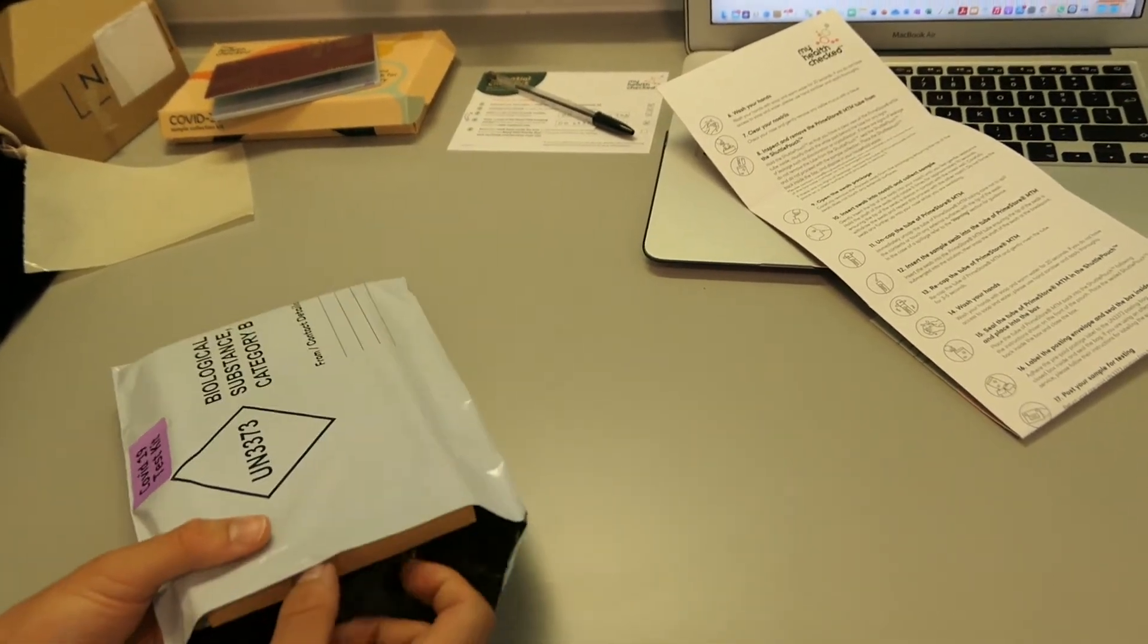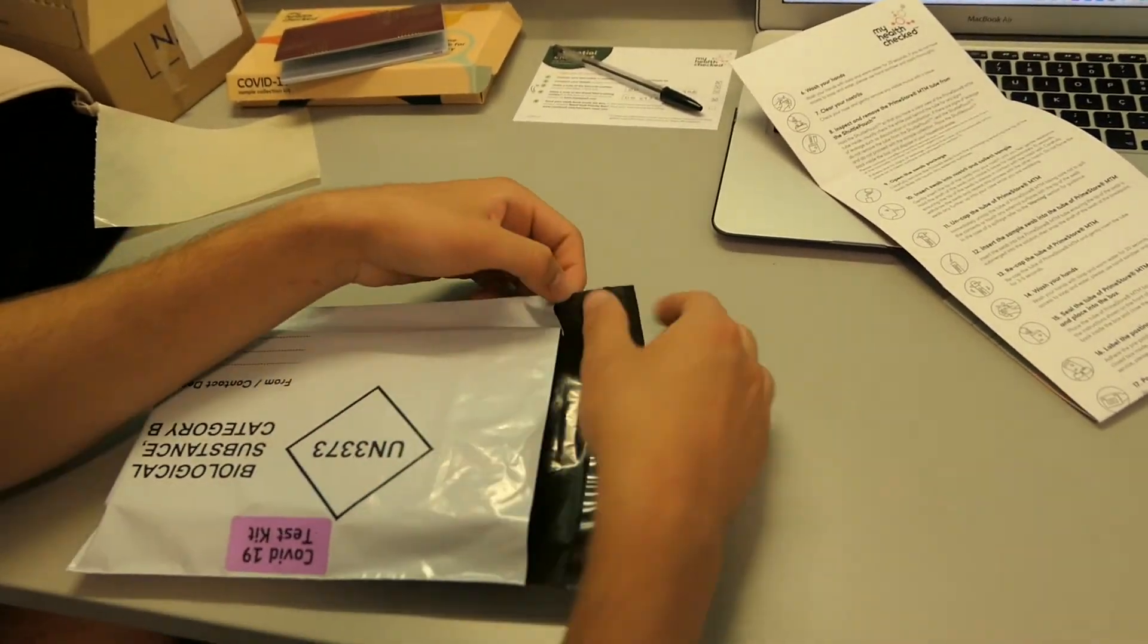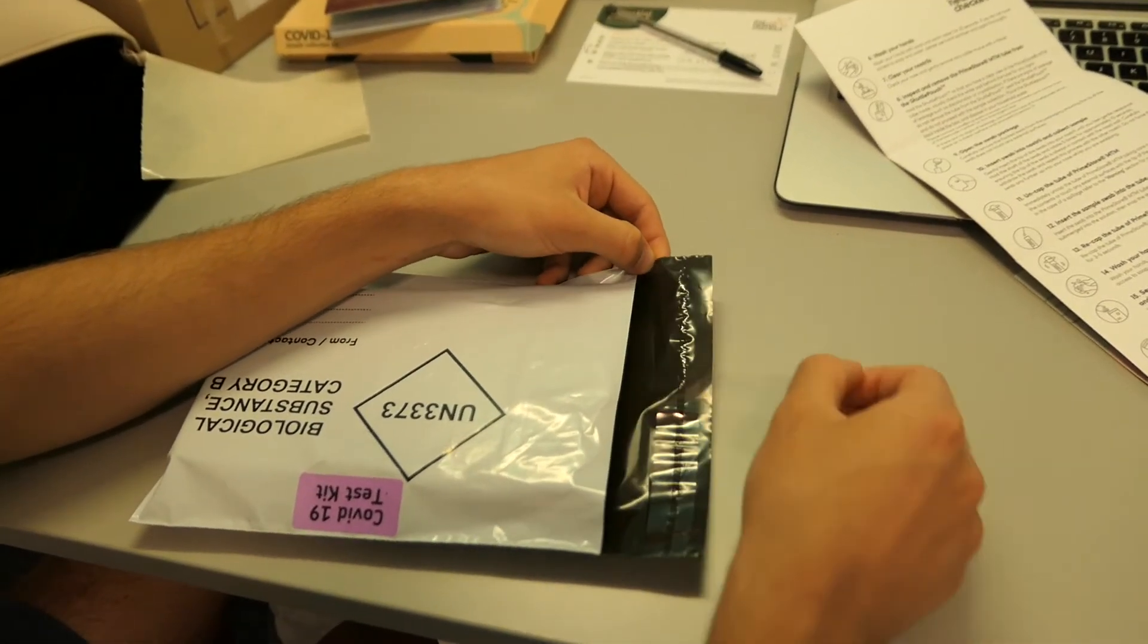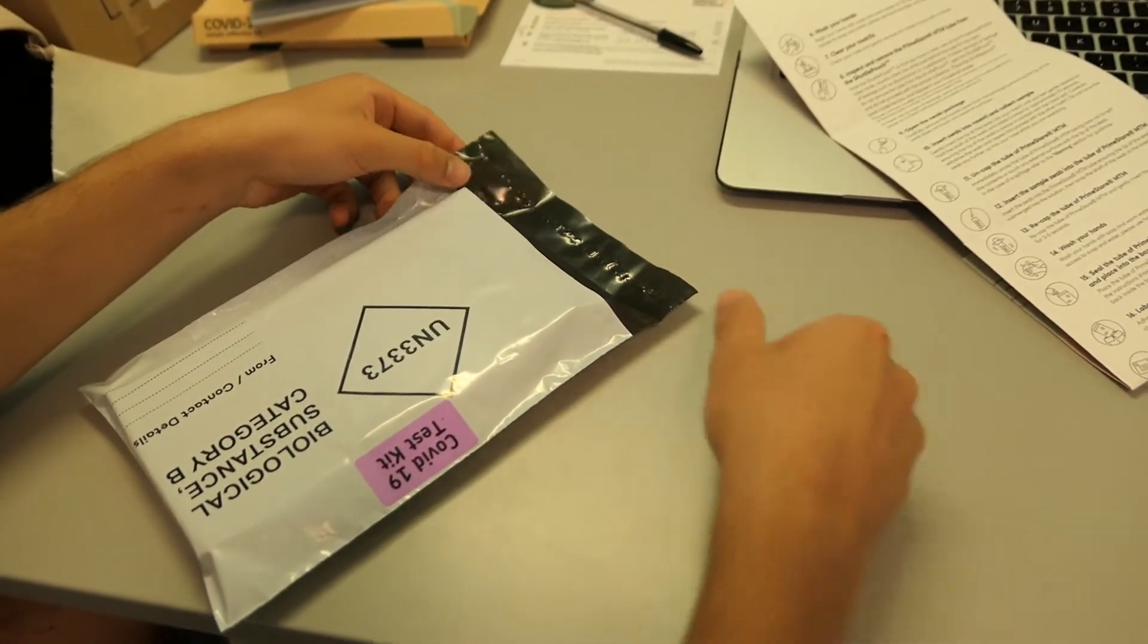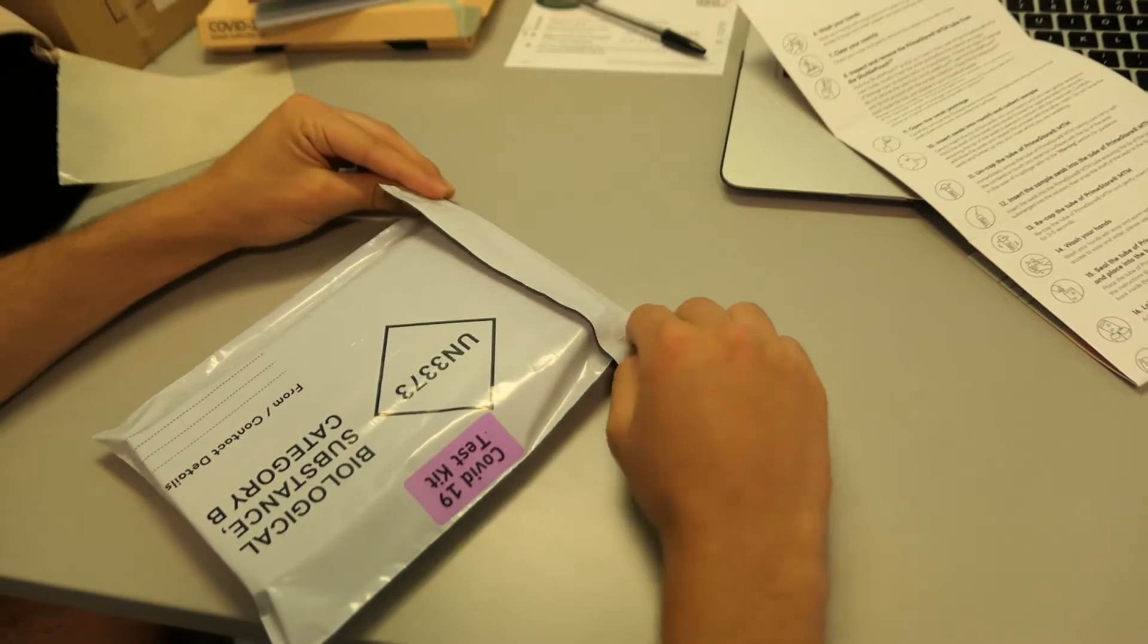Finally, return your prepaid UN-3373 posting bag to your nearest Royal Mail priority post box on the same day as taking your sample. You can find your nearest priority post box and collection times by visiting this site.